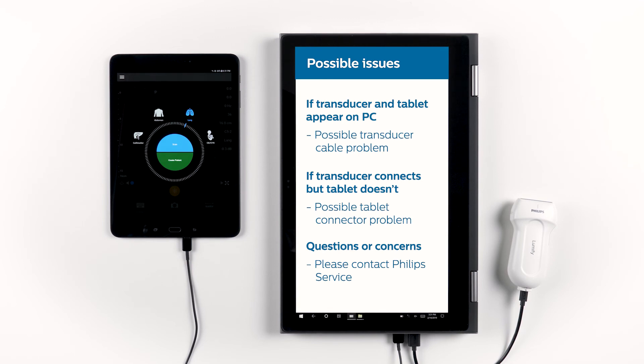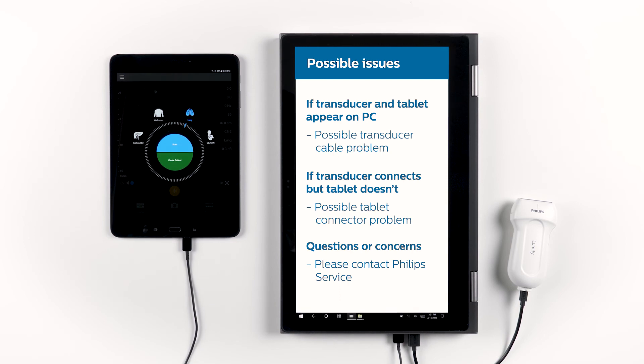In this case, just call your Philips service representative to get a new transducer cable. If the transducer connects, but your tablet does not show up on your computer, then your tablet connector may be damaged. In this case, you will need to replace your tablet.